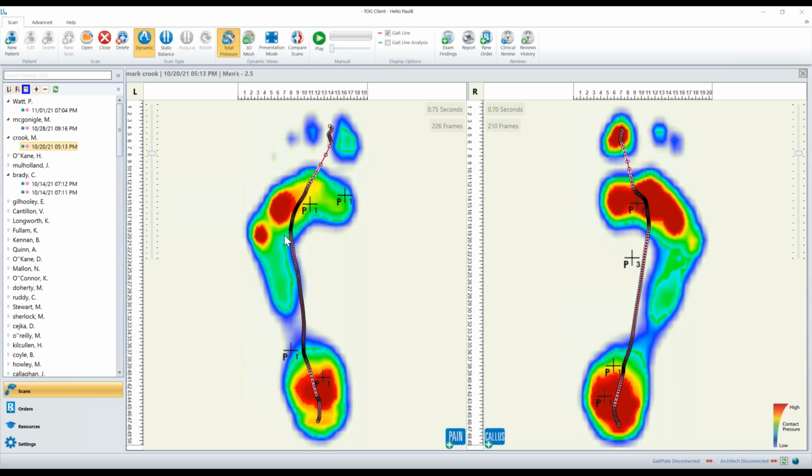When you look at that foot, which is especially a little bit externally rotated, you check to see whether or not their IT band is very tight. Now again, we talked about the system being an aid to diagnosis. This looks, for all intents and purposes, like the big toe joint doesn't work. So we could argue that this is a hallux rigidus. And it could be. But the only way we know this is by you investigating.